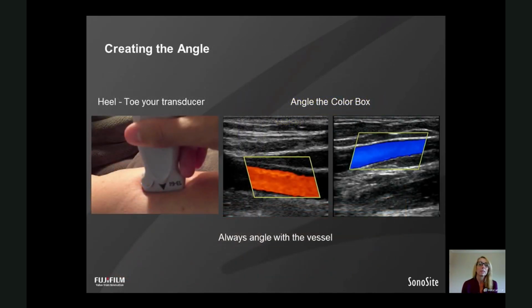So when you're doing your measurements, we're used to in dialysis tending to just use B mode, so we're not that familiar, and we tend to forget that we do actually need to tilt our probe so that we can then work out which is towards and which is away, and also then be able to do a flow measurement because it needs to be able to measure the velocity.